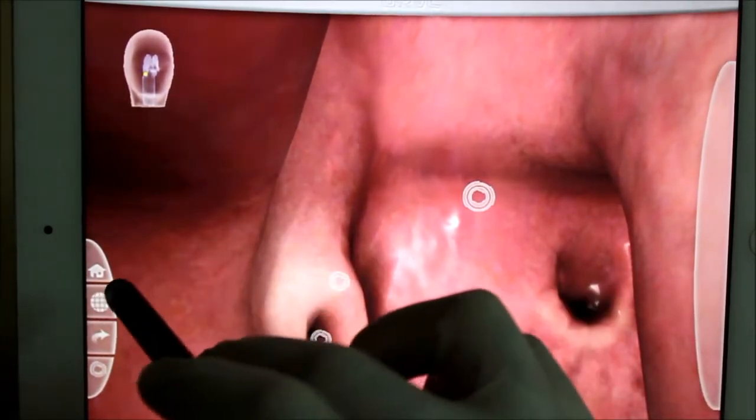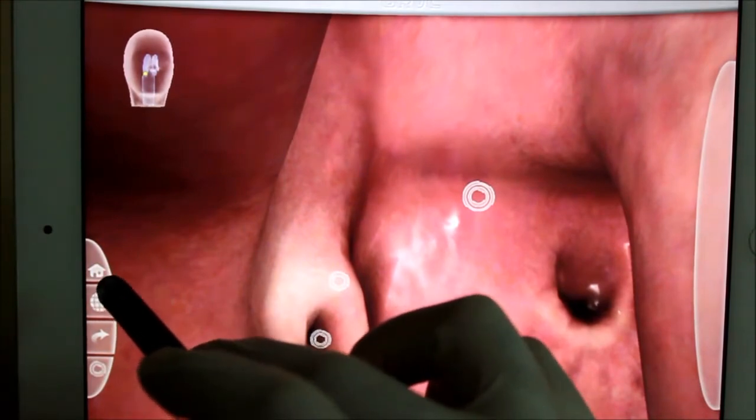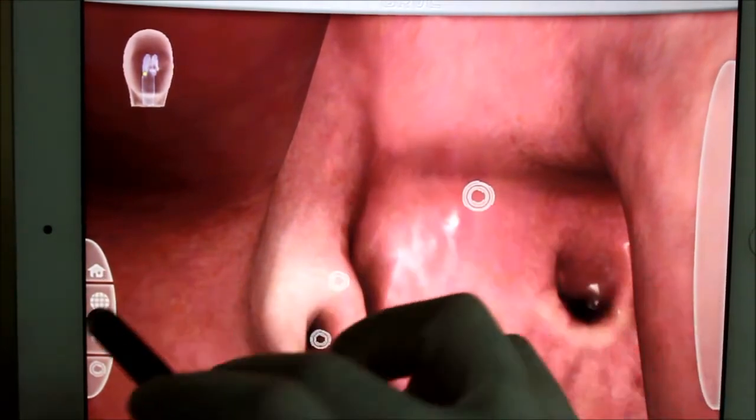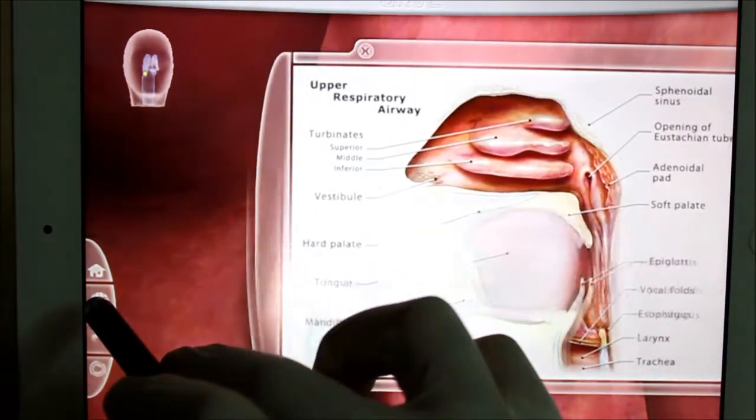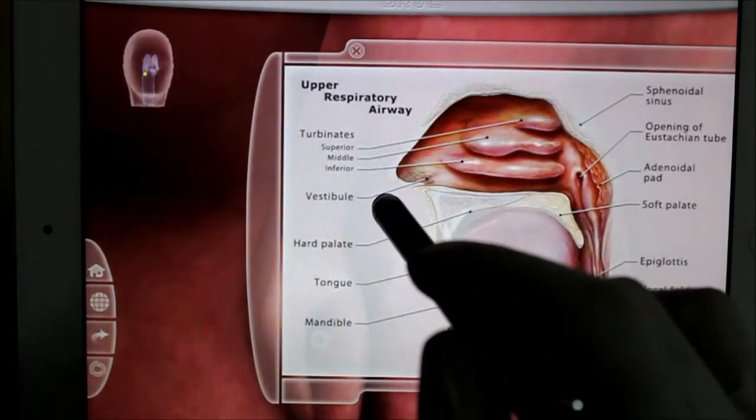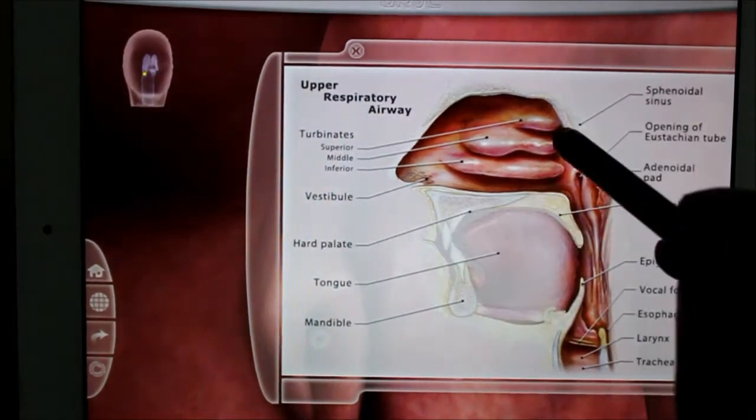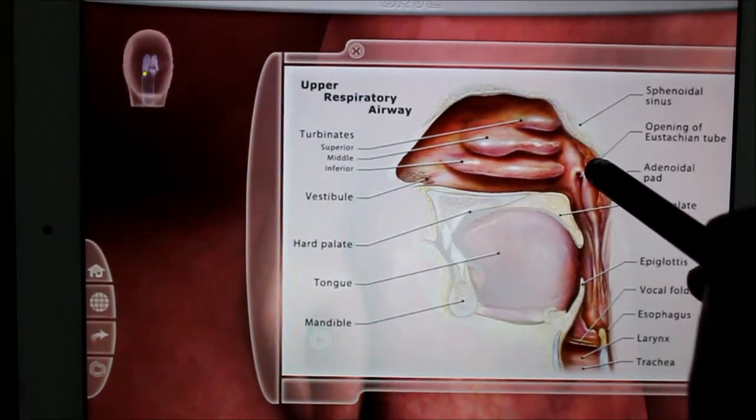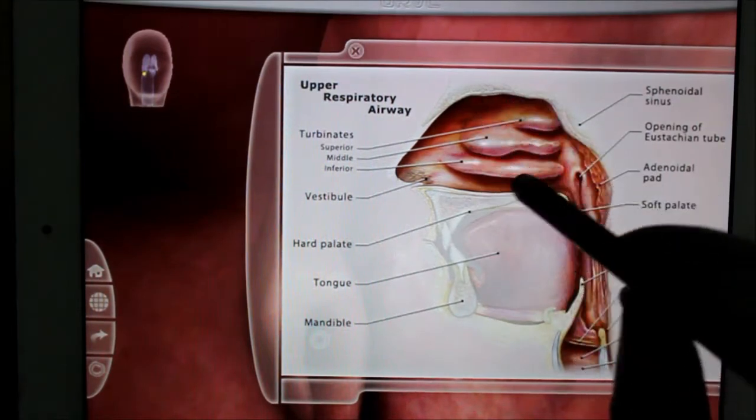nasopharynx, then oropharynx below, then below it we have laryngopharynx. Just to emphasize this point again, here we have the posterior choana because it is the entry to the nasopharynx.